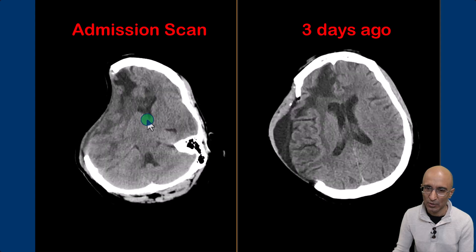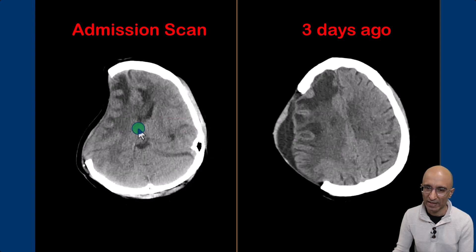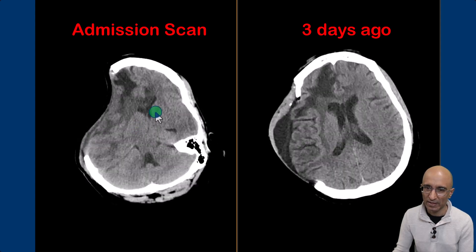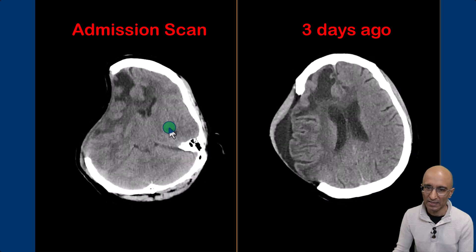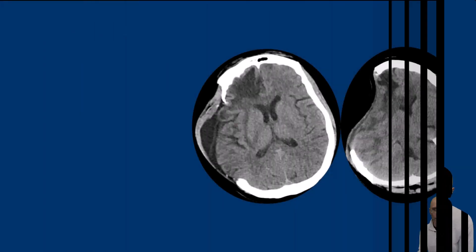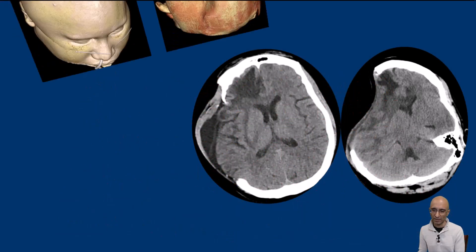You can see the mass effect and effacement of the right lateral ventricle. The left lateral ventricle is mildly dilated. Imaging appearances are consistent with sunken skin flap with paradoxical brain herniation.